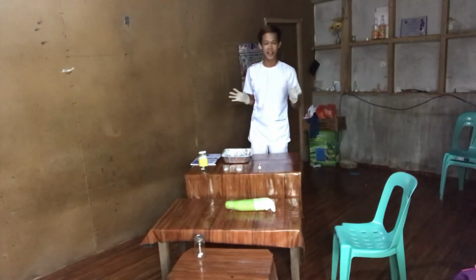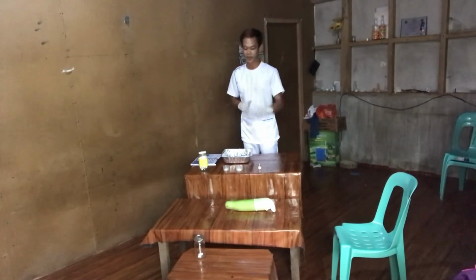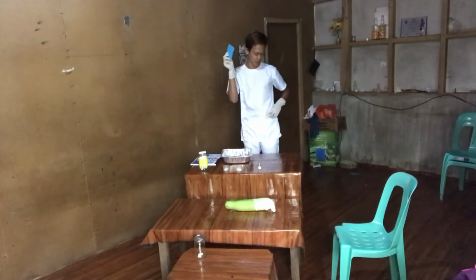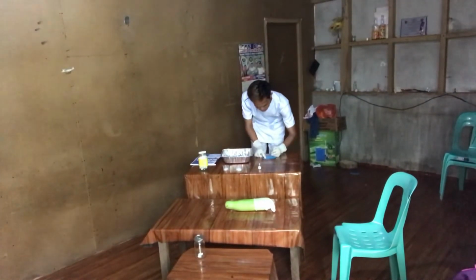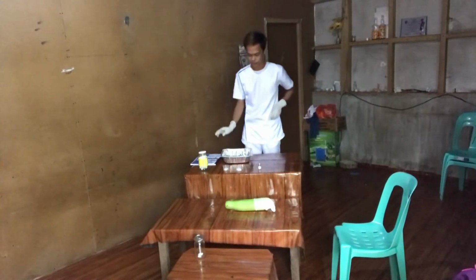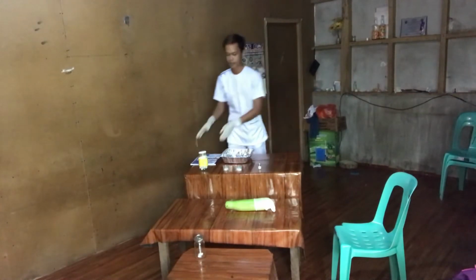And also write the medication ticket, the name of the drug and the dosage, so that we won't forget what medications we administered. On the medication ticket, I'm going to write the medication that I'm going to administer to the patient. So now we're going to transport all of the equipment to the patient.